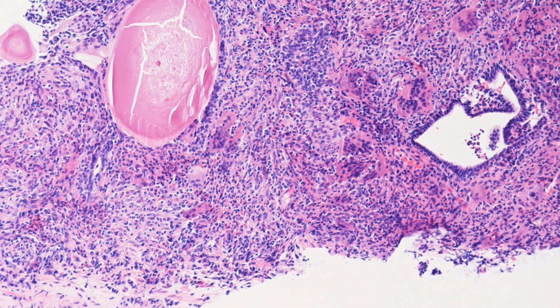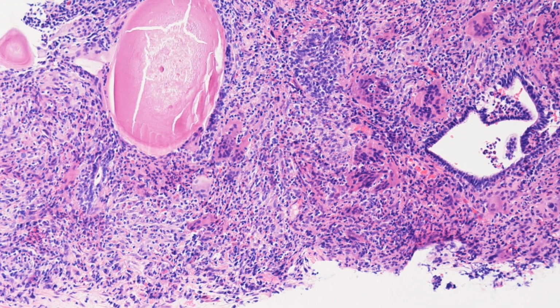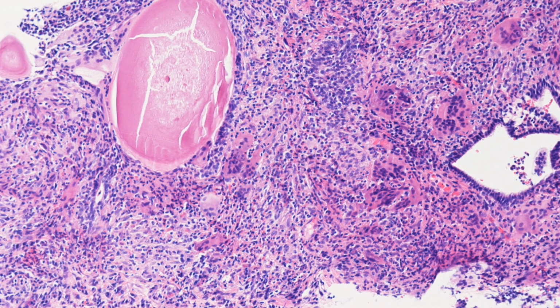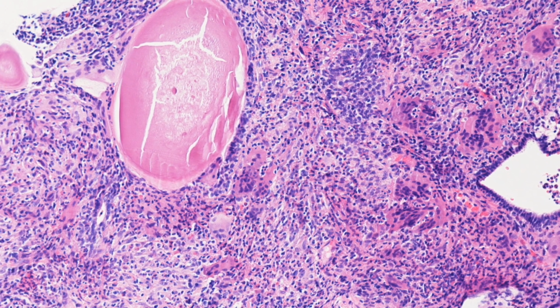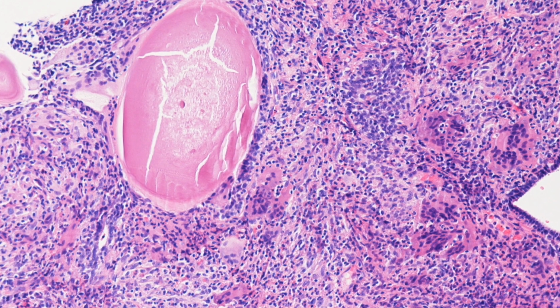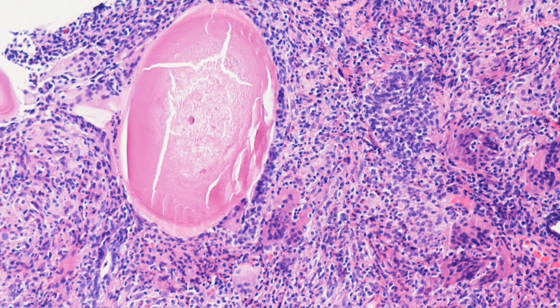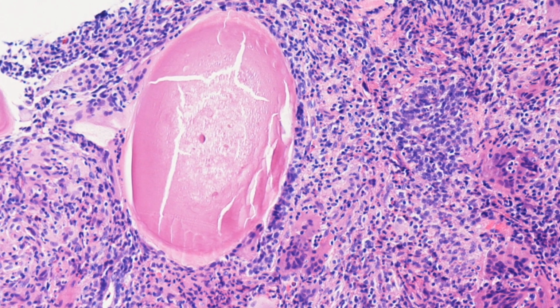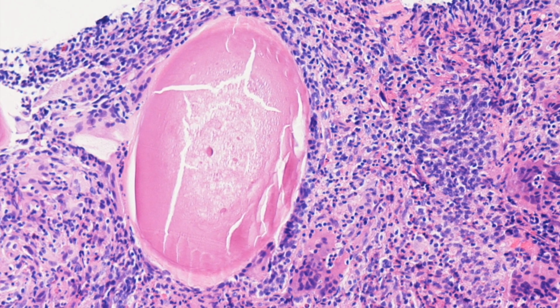Here is a low power view of a prostatic core biopsy showing features of granulomatous prostatitis. We're zooming into a duct containing a calculus, and towards the top end of the duct you can see that the lining epithelial cells are non-existent. So the lining of the duct has been breached, allowing the secretions to gain access to the surrounding prostatic stroma, resulting in the granulomatous prostatitis.